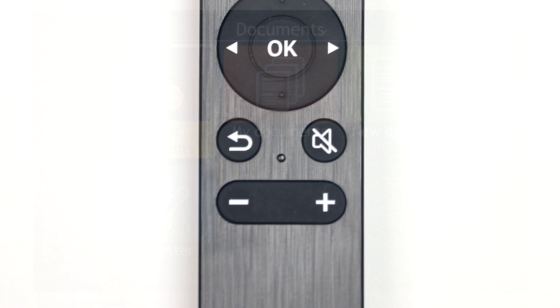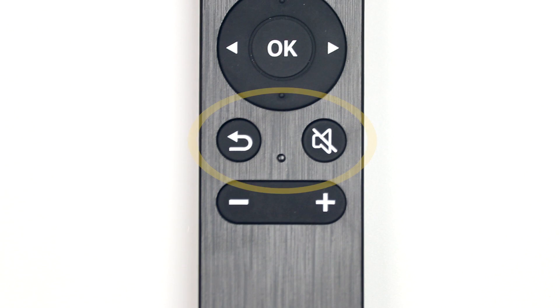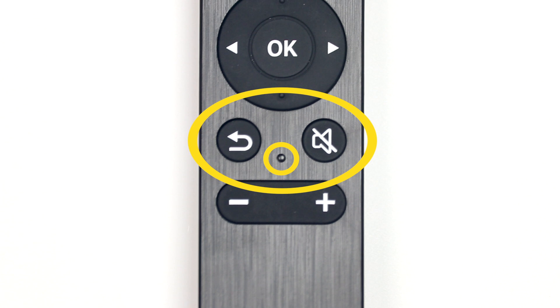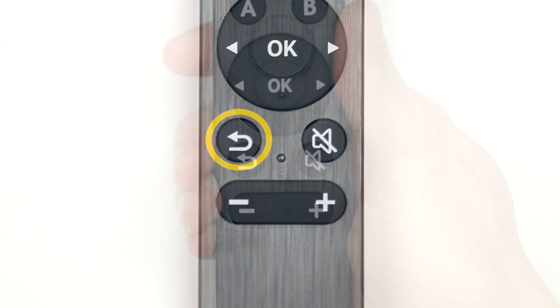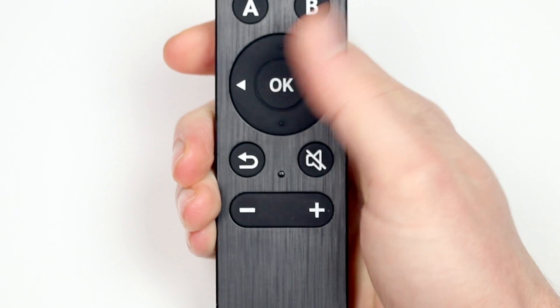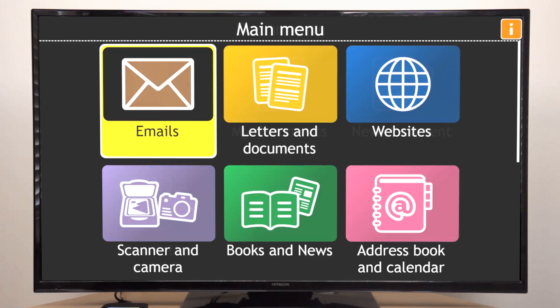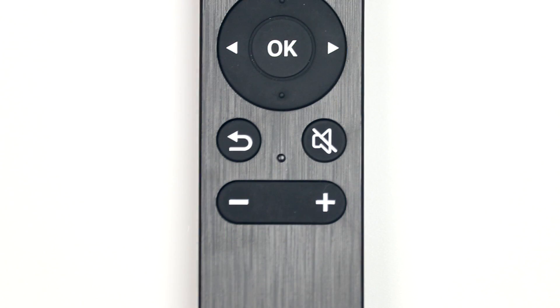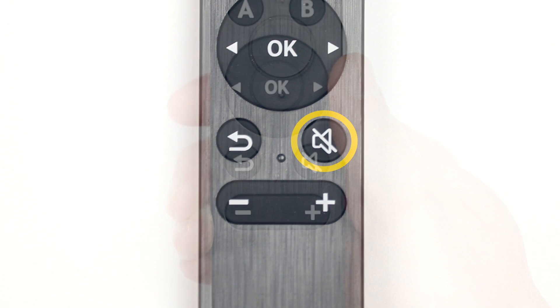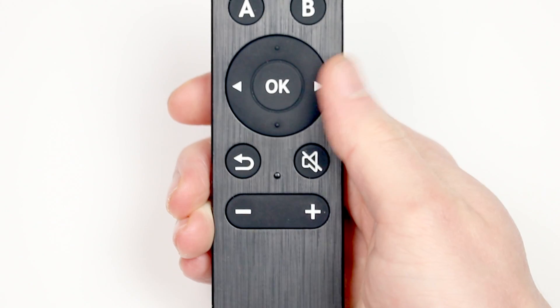The second group is below the circular pad and contains two buttons with a tactile dot between them. The Back button, to the left of the dot, moves you back to the previous screen. The Speaker button, to the right of the dot, will interrupt and repeat the speech.